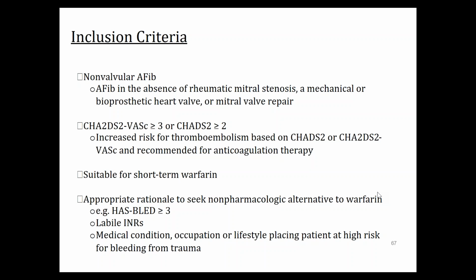And so in Europe now, they're already not putting people on warfarin. I've got a lot of colleagues across the country that say, boy, if they're this high risk, we're not going to do the 45 days of warfarin. We'll just do Plavix and aspirin. And the Plavix and aspirin are just to prevent anything from forming on the face of that device until it's re-endothelialized. So there's ways we can do it.